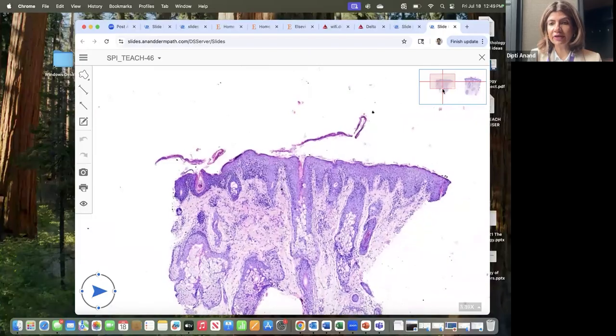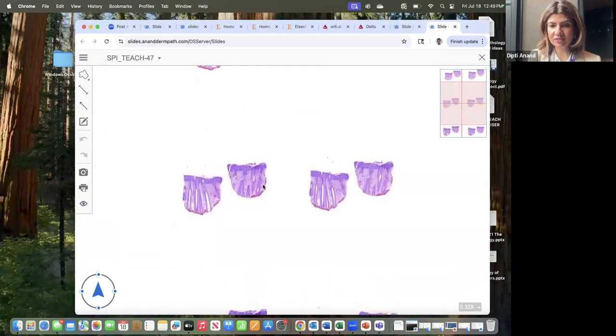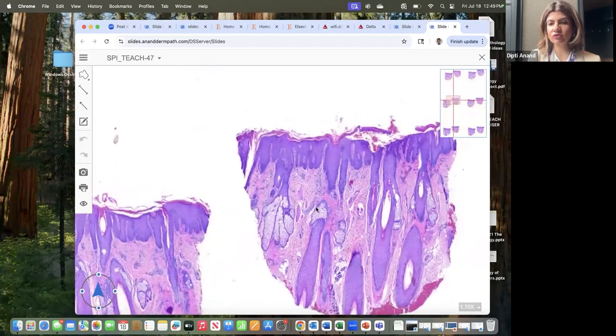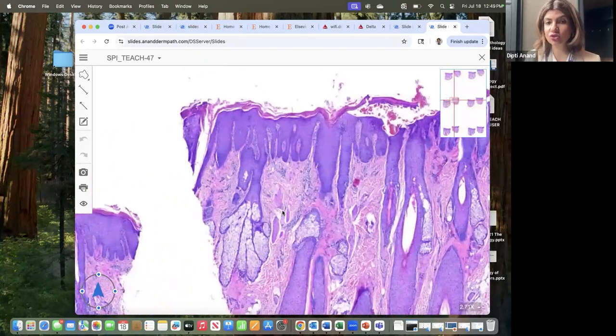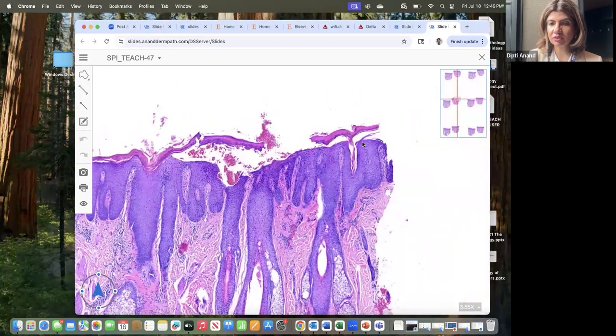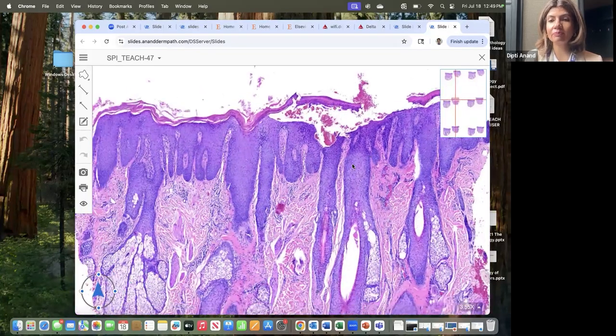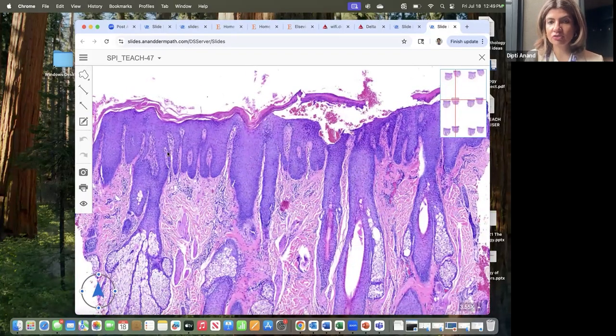Okay. Very often, I like to refer to this as scalp psoriasis. So for example, in this biopsy, if you said this is sebderm or psoriasis, it is actually both. Because you see here, there is psoriasiform hyperplasia, suprapapillary thinning, loss of granular cell layer. So this is psoriasis, but you also see sebderm because you see parafollicular parakeratosis. So this is what is referred to as scalp psoriasis or sebo-psoriasis, wherein you see features of sebderm and psoriasis. This is more of a practical thing to remember rather than a histology slide.